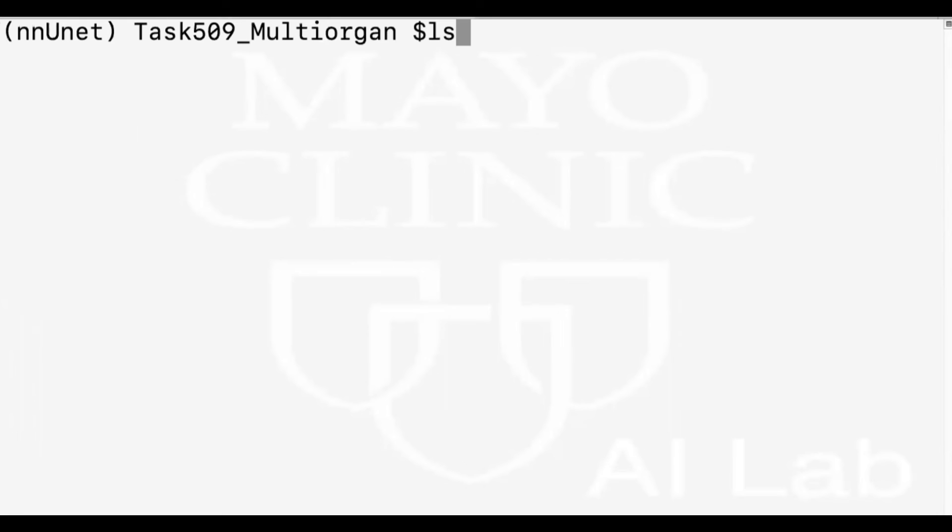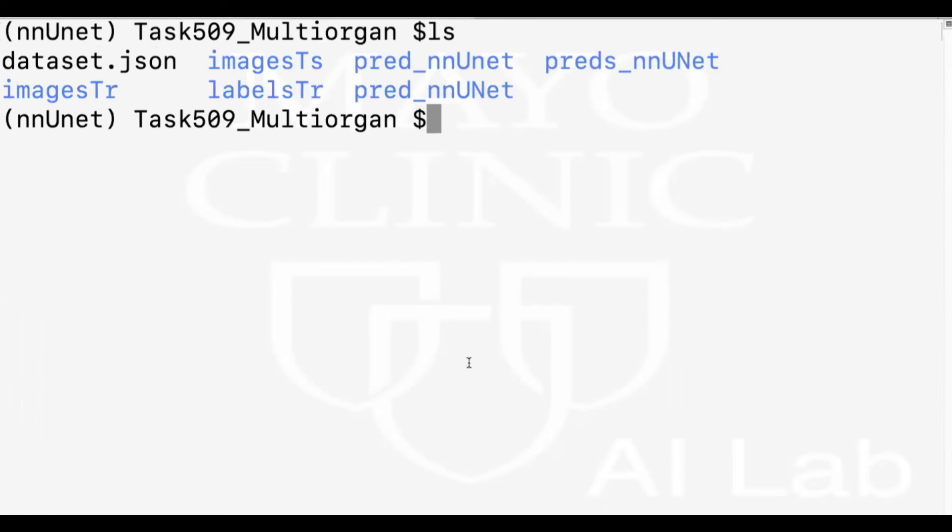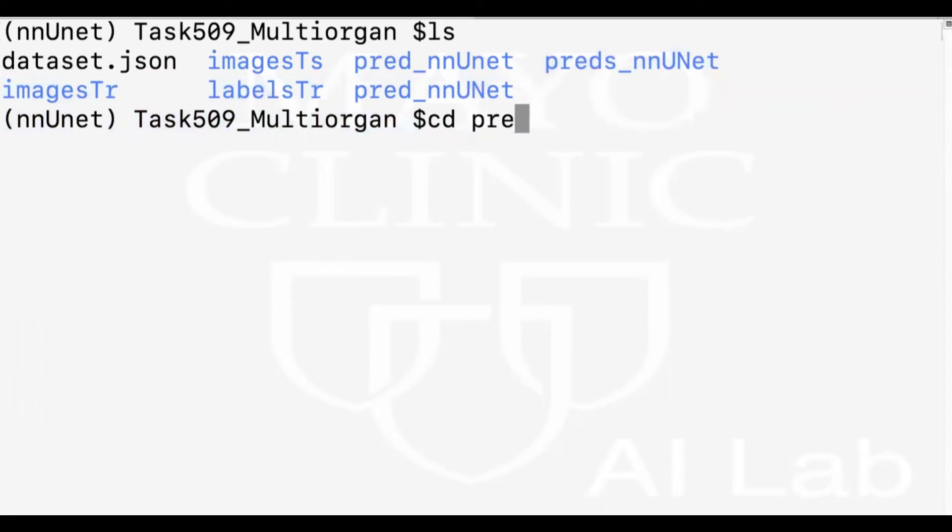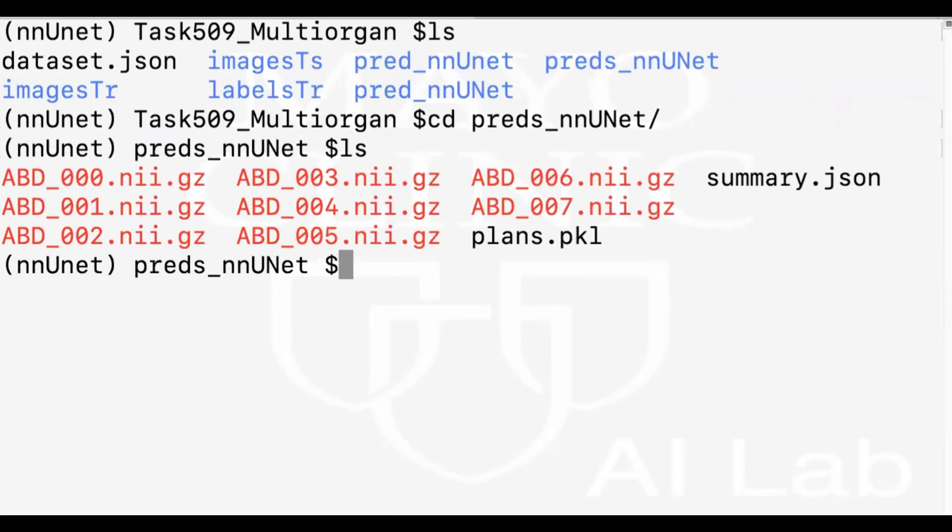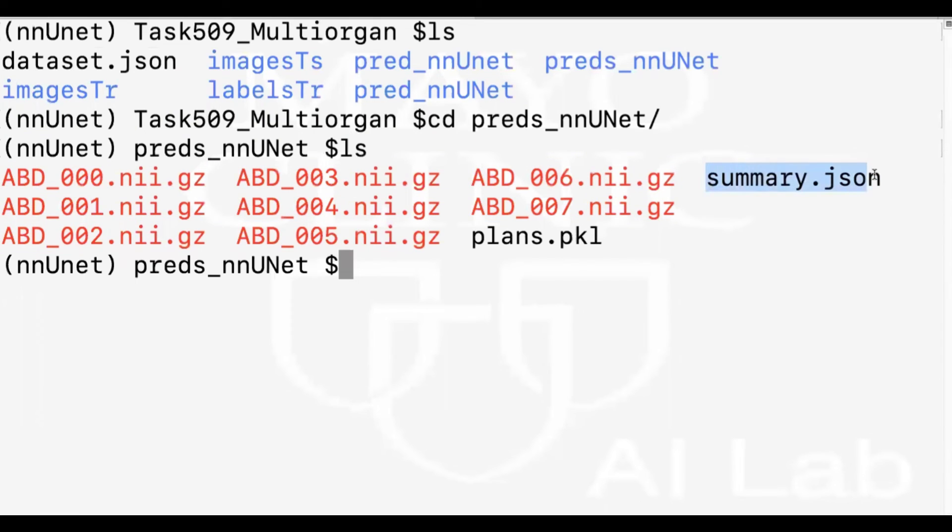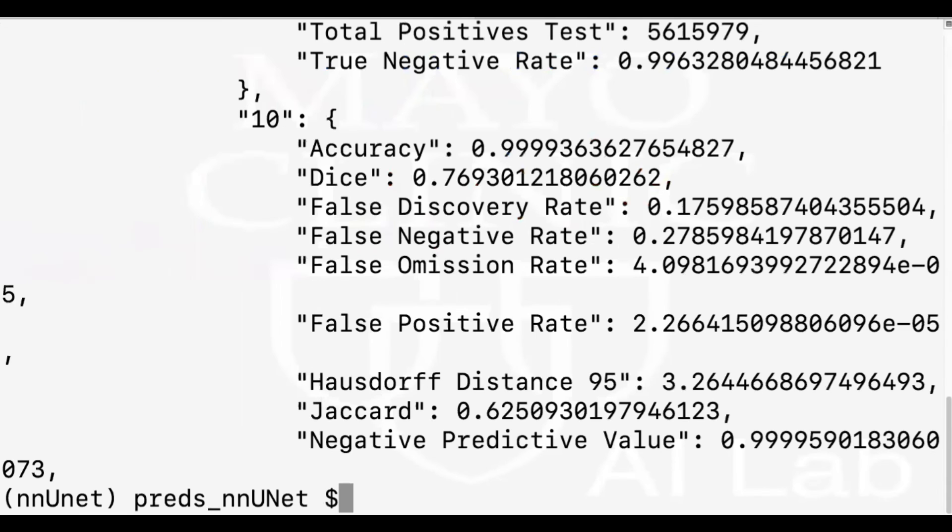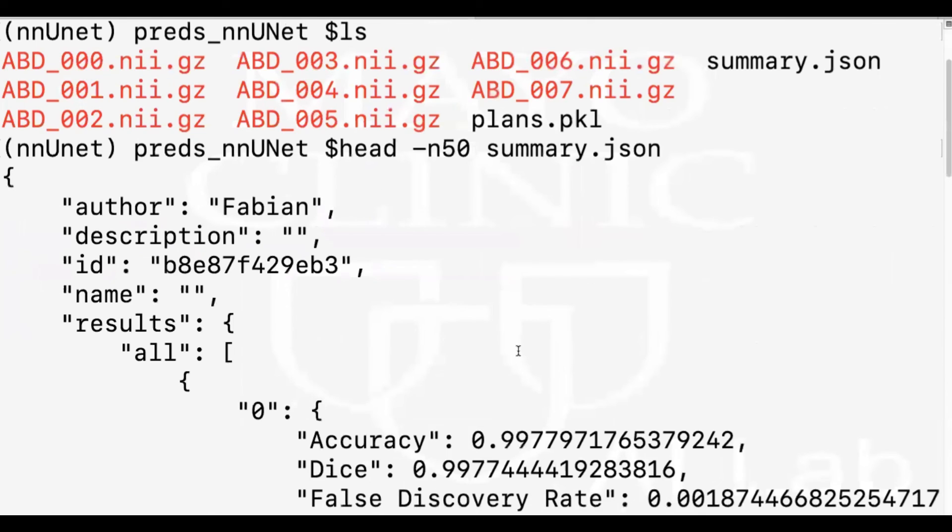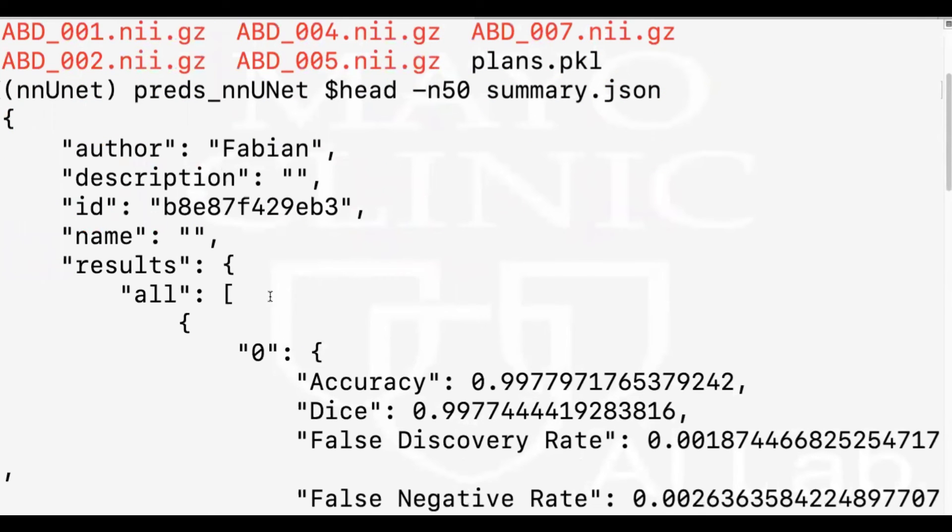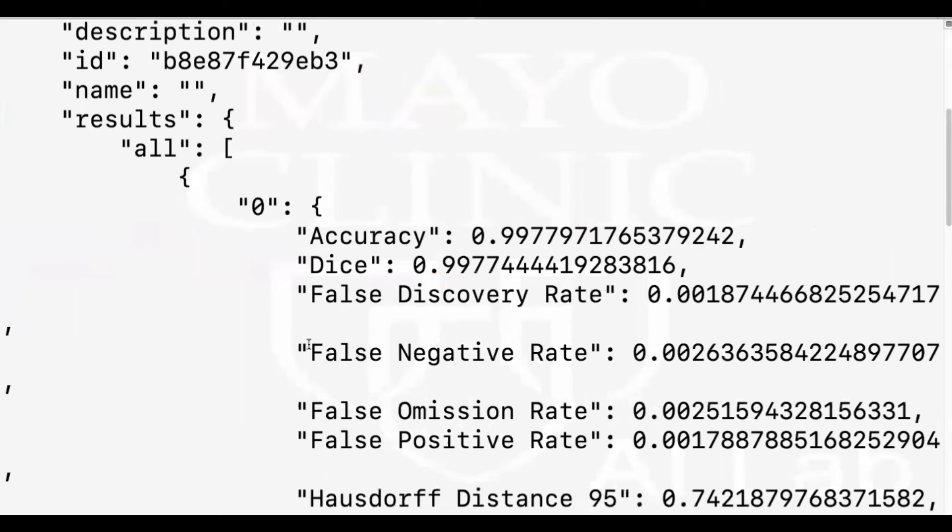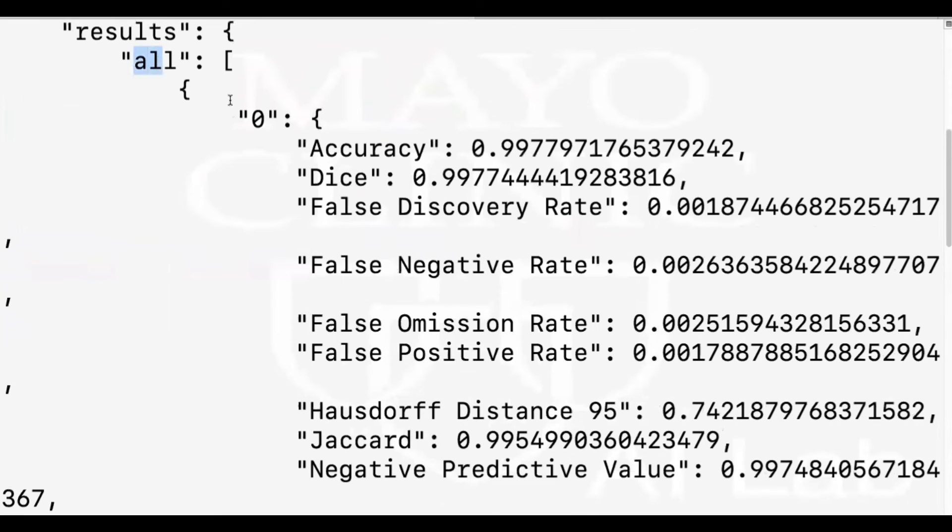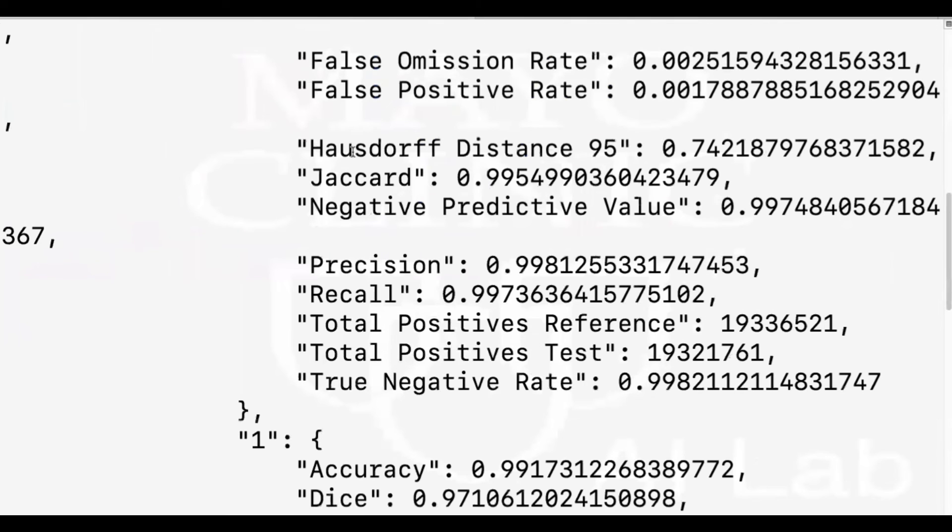So now if I show the task folder, we have the predictions in a folder called preds_nnUNet. Now you'll see all the eight test images have been predicted as you'll see here. And then the metrics are calculated in a file named summary.json. So I'm going to show you the first 50 lines of this file. And as you see, the metrics for all test images for each label are calculated.